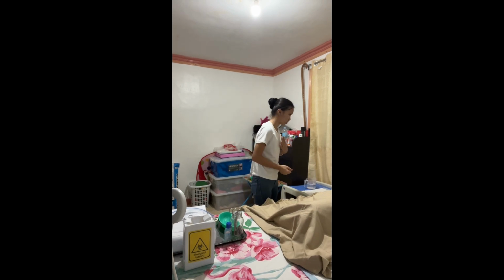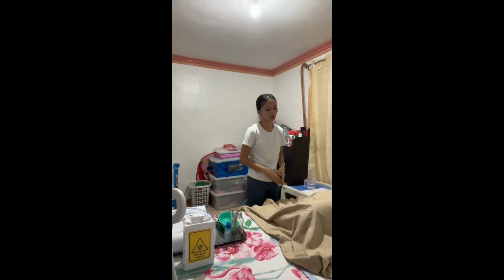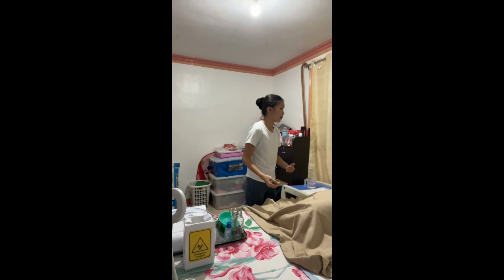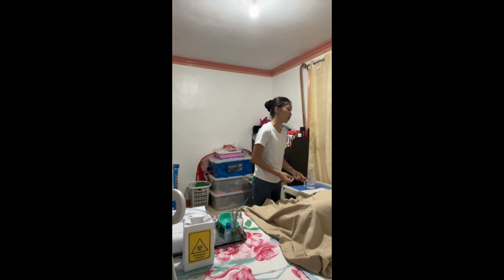Next, we are going to identify the patient and explain the procedure to let the patient understand and gain the patient's cooperation. Hi, good morning ma'am. My name is Caster Kaima, your student nurse for today. May I see your wristband please? Can you state your complete name? Alright. Now ma'am, I am going to insert a catheter in your urethral meatus for you to excrete the urine in your bladder. Would that be alright? Okay, thank you.